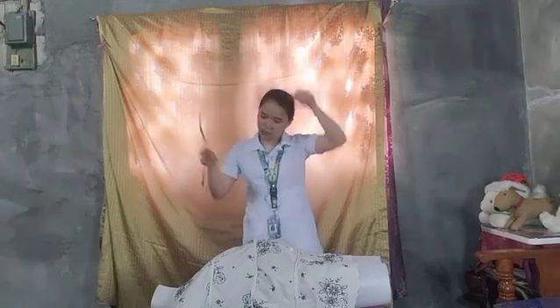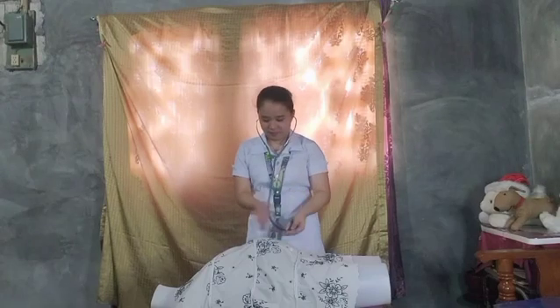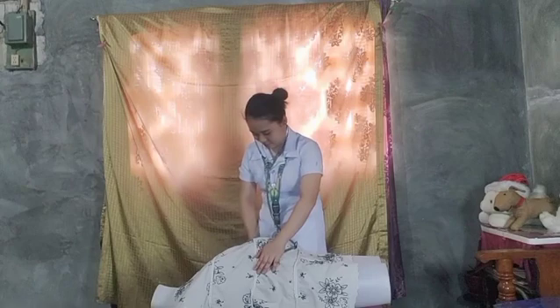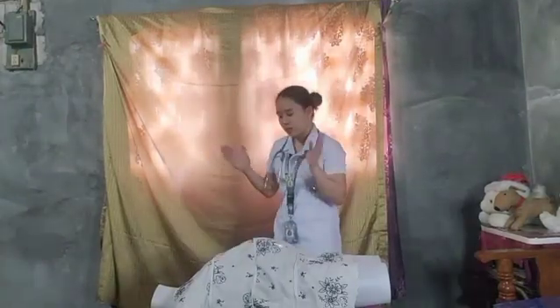Next, auscultate the fetal heart tone. And once you determine where the fetal back is, start counting the fetal heart tone using the stethoscope. Lastly, explain to the client regarding the data that you've gathered.